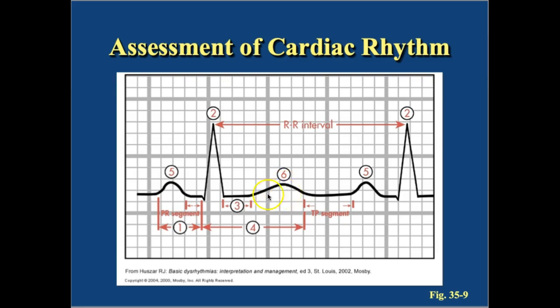All of those things can mean different things like elevated potassium. Usually it's electrolyte imbalances, things like that. So make sure you understand what can cause the ST segment to be elevated or depressed and what can cause the T wave to be unusual in some way.